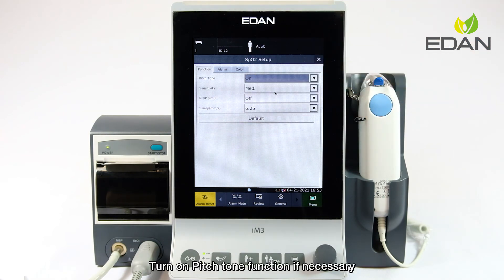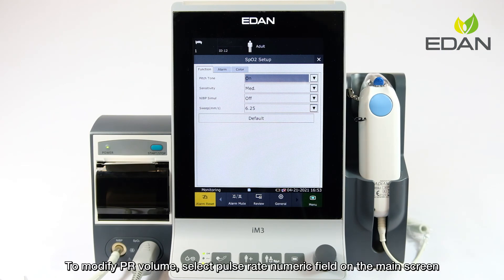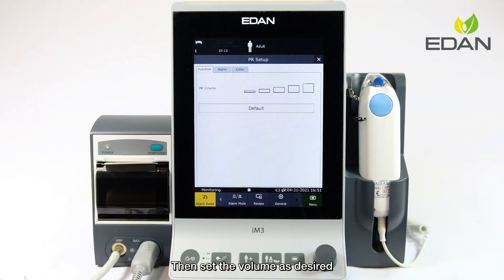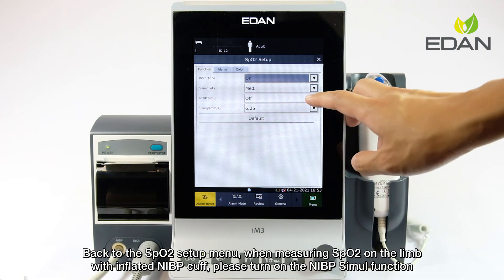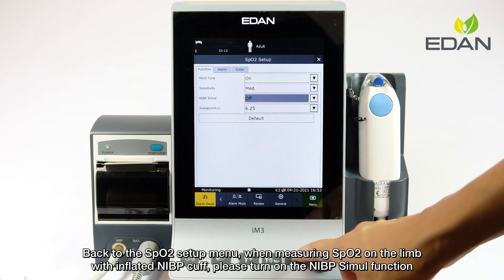Turn on the pitch tone function if necessary. To hear the pitch tone, make sure the PR volume is not muted. To modify PR volume, select the pulse rate numeric field on the main screen and set the volume as desired. Back in the SpO2 setup menu, when measuring SpO2 on the limb with an inflated NIBP cuff, please turn on the NIBP simul function.